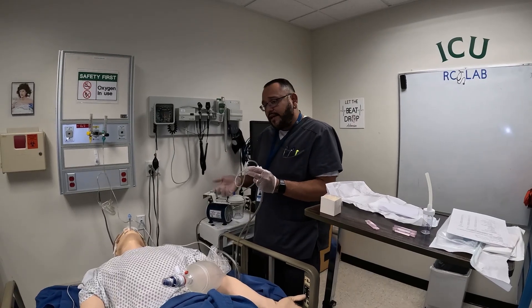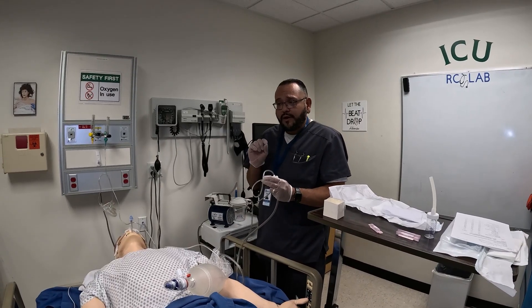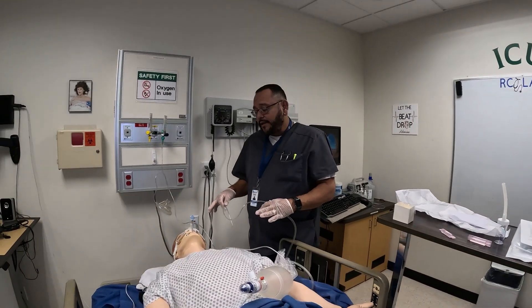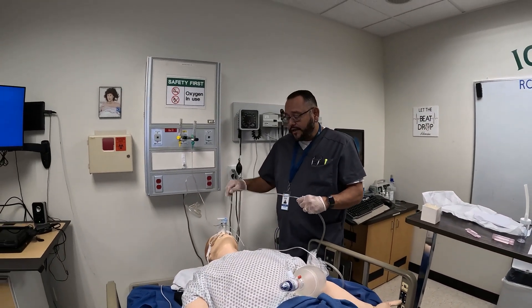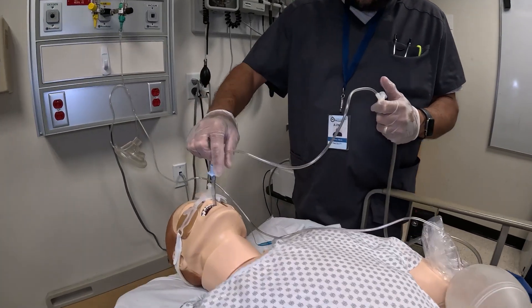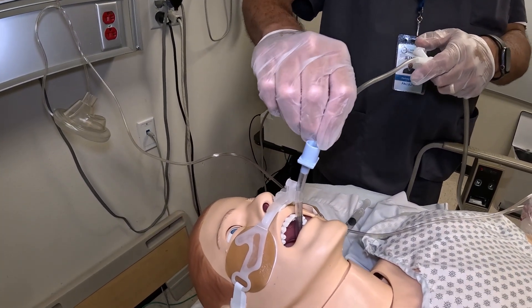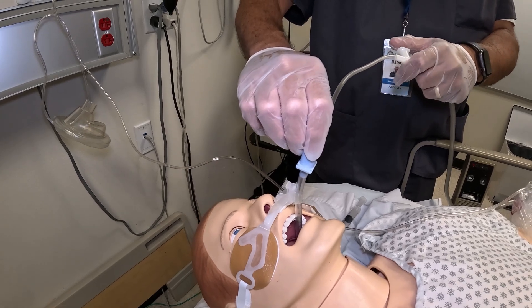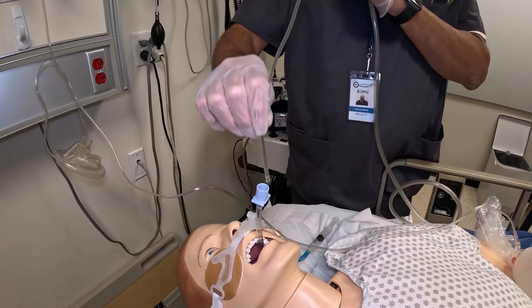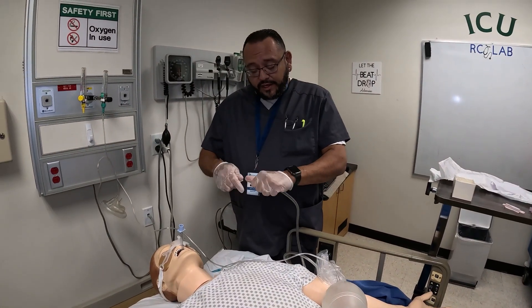Anything you suction out is going to go through here into your canister, and you will visually assess what type of secretions you have: are they green, yellow, white, clear, or thick? Also note the amount — are they copious, small, or moderate? After giving the patient a breath or two, I'm going to pass again using the same technique. If you meet resistance don't force it, and if you get a gag reflex that's your indication to stop there. You suction on your way out — you never want to suction as you're going down.